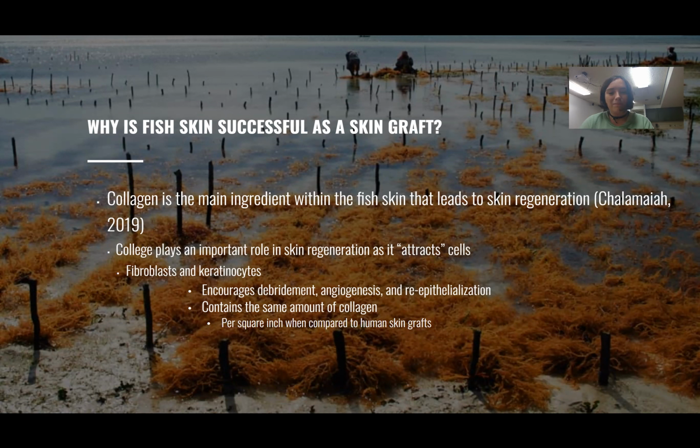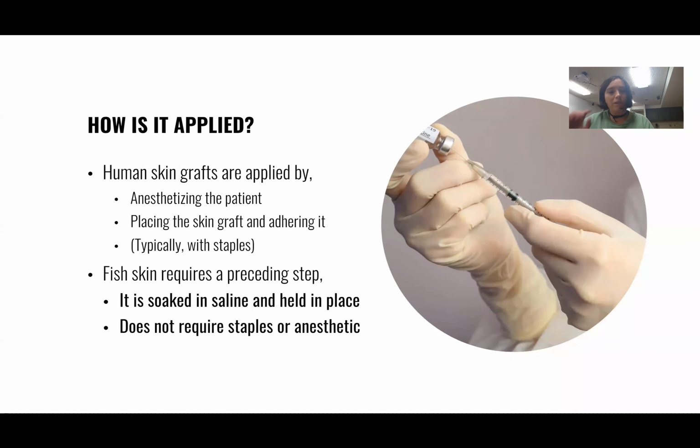These contain the same amount of collagen per square inch when compared to human skin grafts. Nile tilapia actually contain the most amount of collagen, which is why they were utilized in most of the studies that we observed. So how are skin grafts applied?